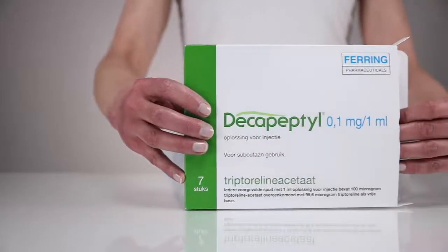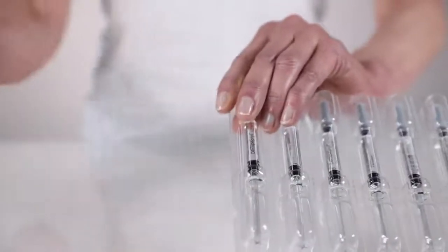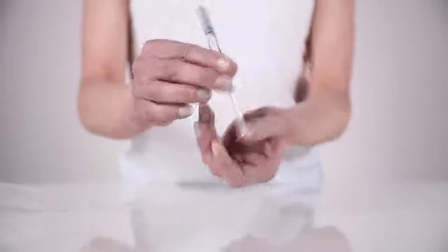Open the box with Decapeptil syringes and tear off the blister pack with one syringe from the other syringes. Open the pack by pulling open the plastic on the back of the pack. Take the syringe out of the blister pack.